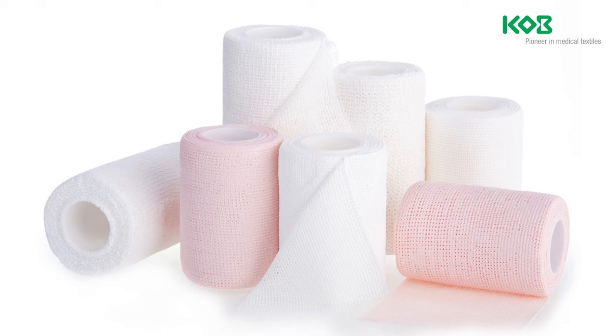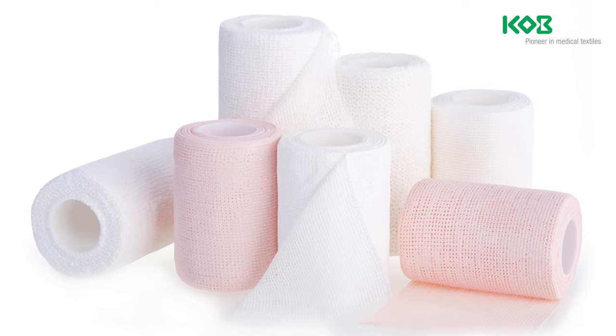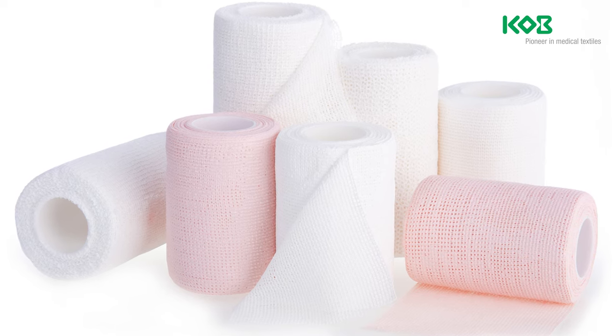the zinc paste product portfolio of KOB includes rigid and elastic versions. KOB also offers bi-elastic zinc paste bandages for greater comfort.